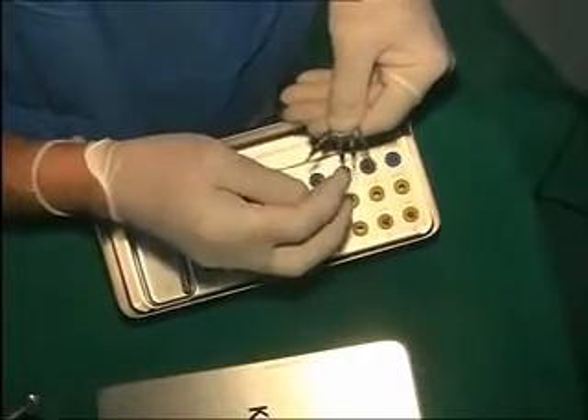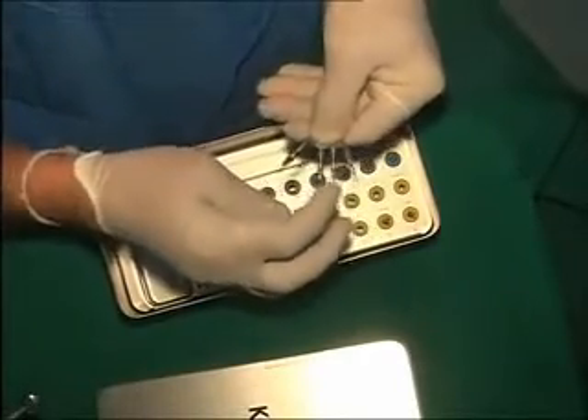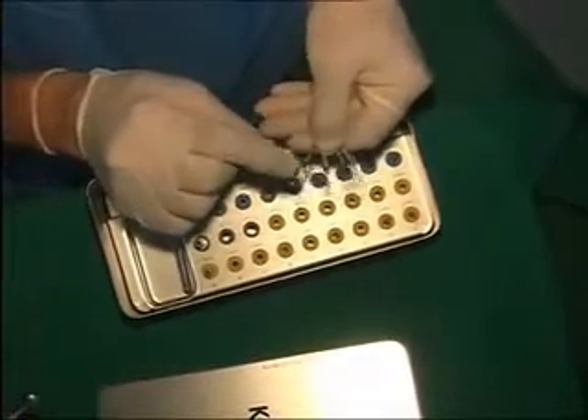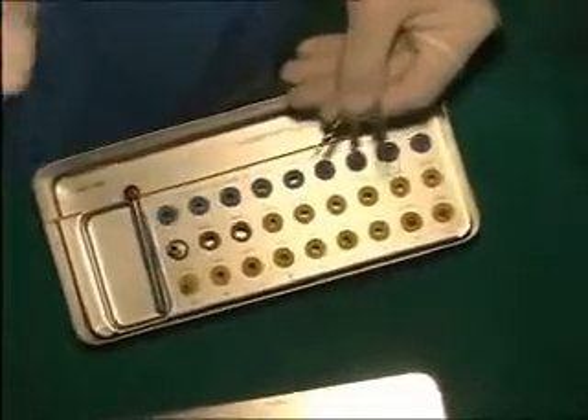So the thinnest is first, second, third, fourth — DOS 1, 2, 3, 4. Then they have got the markings: 8, 10, 12, 14.